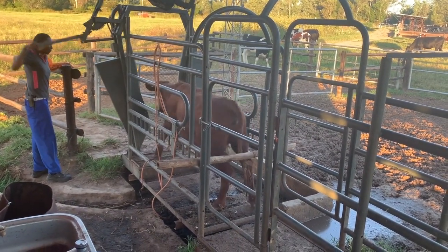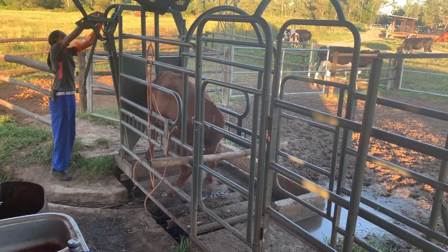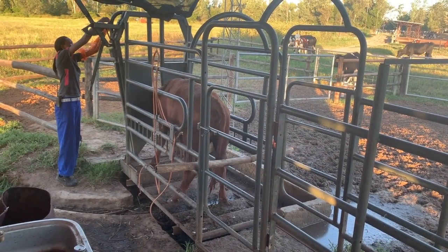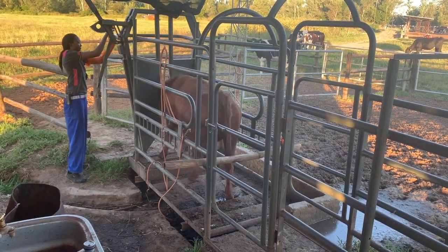The Red Dane tip of the month is artificial insemination. First thing you do is bring in the heifer or cow that has been heat spotted on standing heat 12 hours previously. You restrain her in a good crush, trying to keep her as calm as possible.